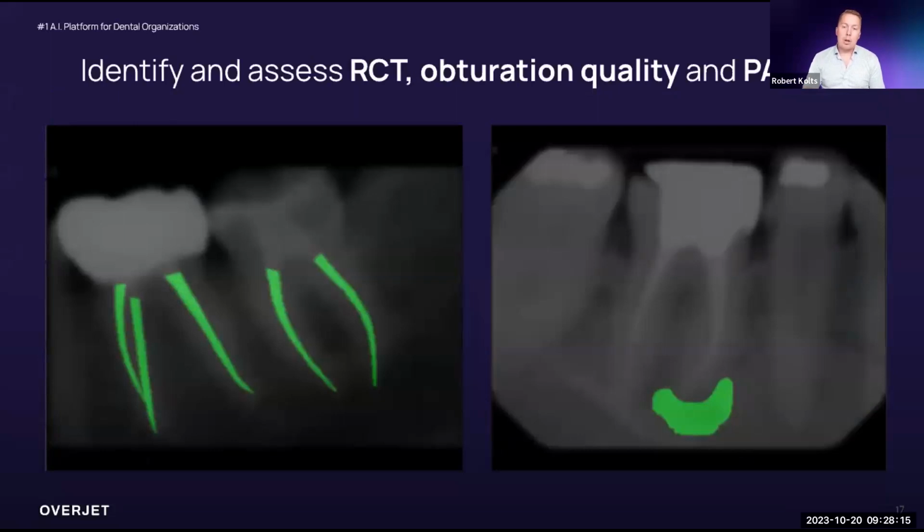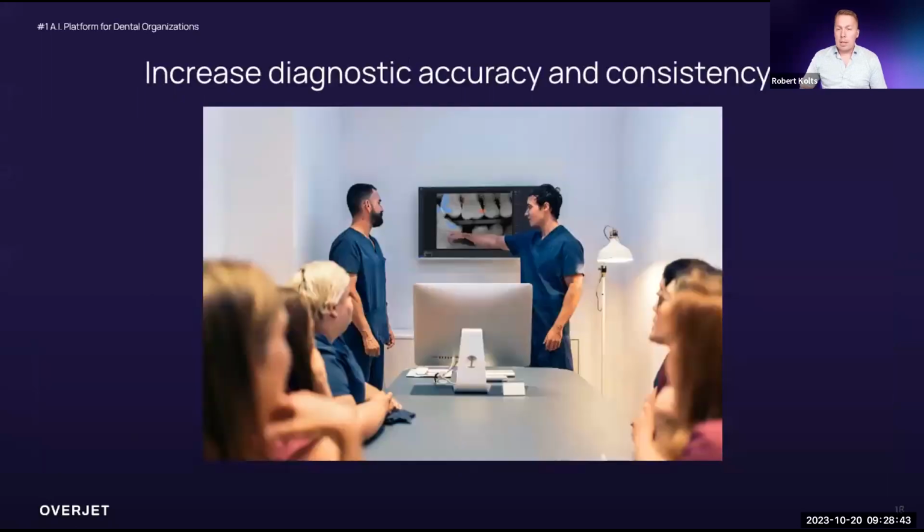And if you think long-term as you're using this, what impact could this have? This has the ability potentially to recognize quality of an obturation, distance from the apex for a short or elongated fill, expelled sealer through the apex of the tooth, to determine size of an apical lesion, and then determine over time in a more objective fashion if the size of that lesion is changing, within the constraints of angulation and things, of course. And so really, again, coming back to that accuracy and that consistency, this is one of the areas that I think AI is making the biggest impact for.